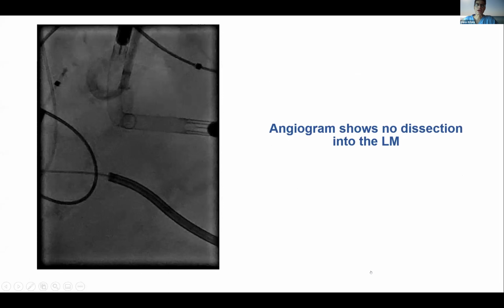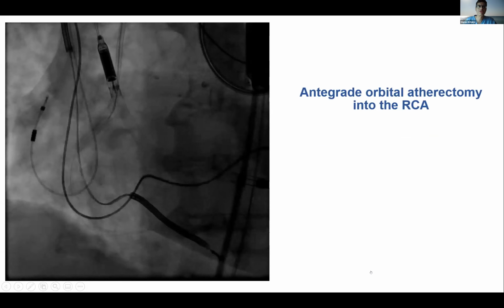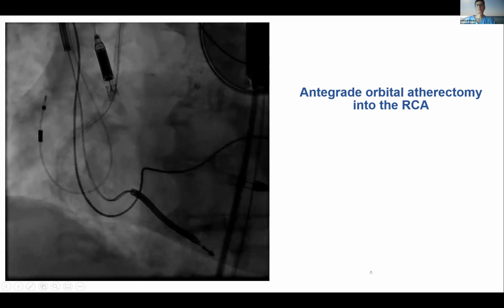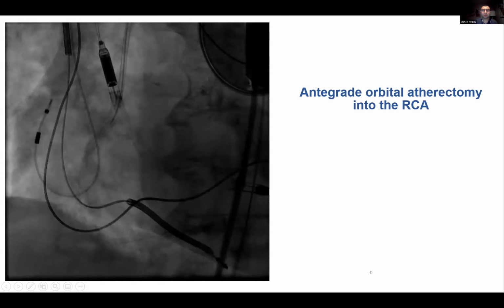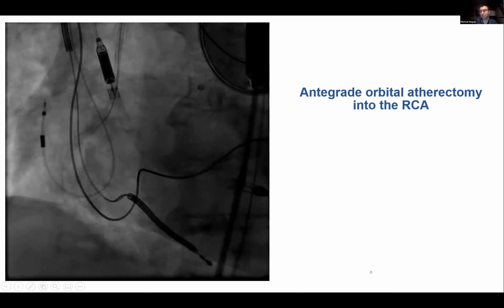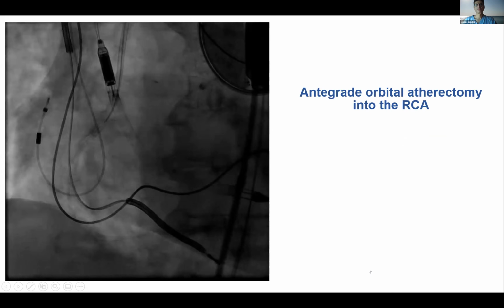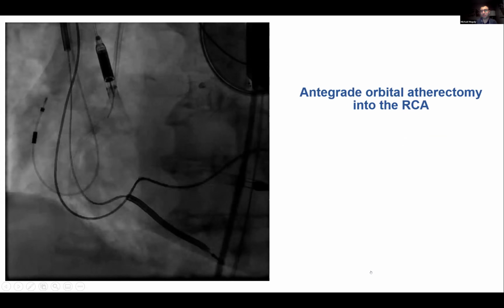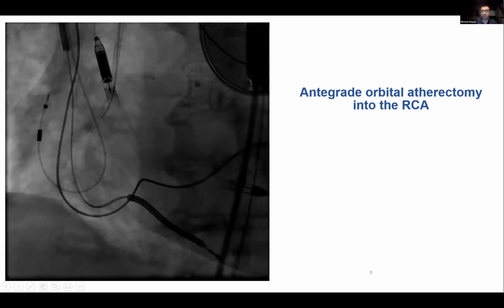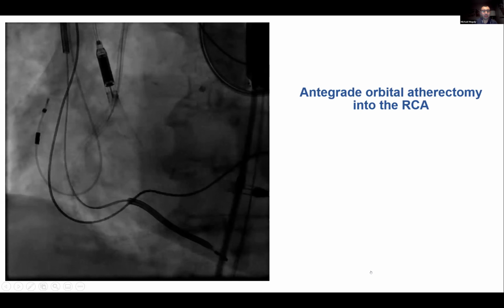Did you do a right heart cath, where the PA pressures go up when you're doing atherectomy, or you didn't use right heart cath during this? We didn't use right heart cath because there was no doubt in this case that we're going to use Impella with a single ostium. We usually do it if we have any doubt, but in this case it was a pretty straightforward decision. Perfect.